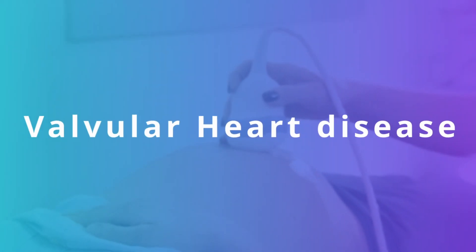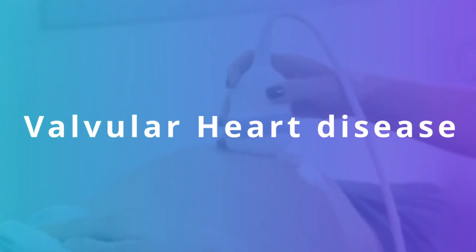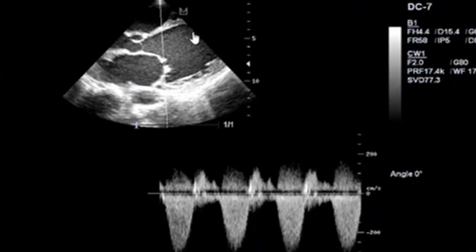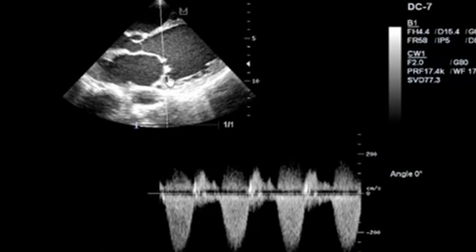In this presentation we are going to discuss valvular heart disease. We have our left ventricle here and our left atrium here. The mitral valve shows doming and you can see that the mitral valve is stenosed and calcified.